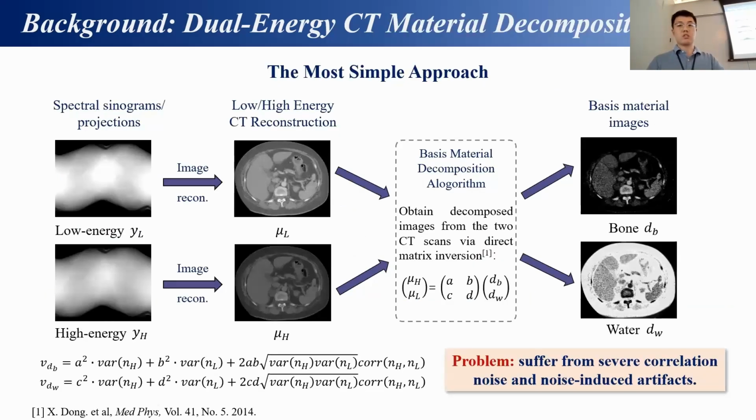So dual CT images have different material decomposition methods. Here is the most simple image-based approach. The dual CT images can use this direct image-based decomposition algorithm to obtain the basis materials, and achieve quantitative and qualitative analysis and identify the structural components of the lesion, which has important clinical diagnostic significance.